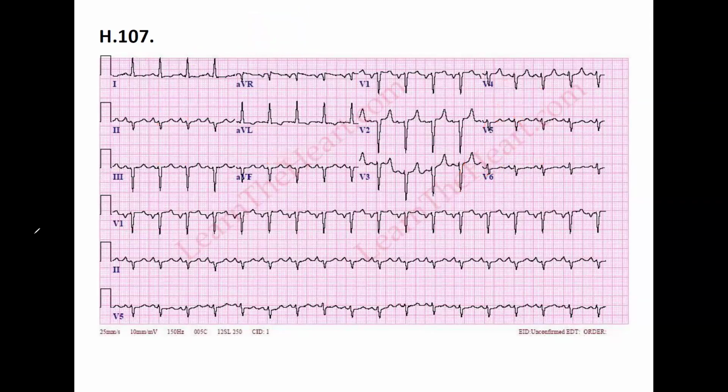All right. Let's see the next one. Okay, Victoria. Yes. I'm getting you a nice ECG.